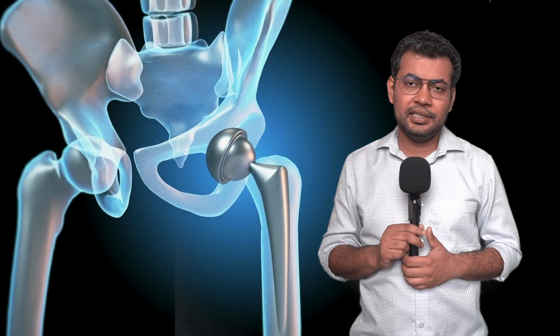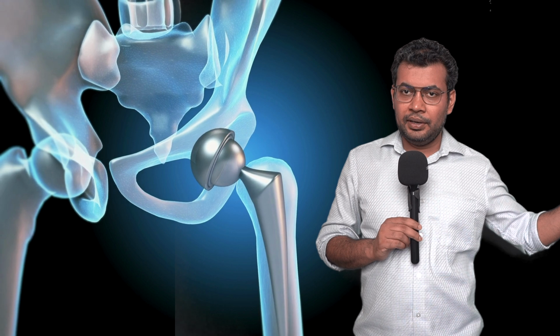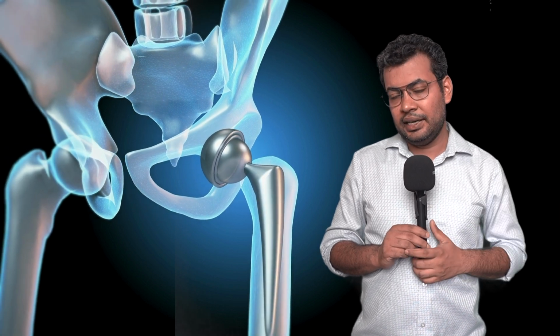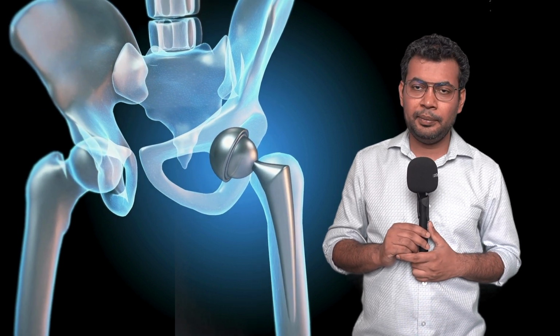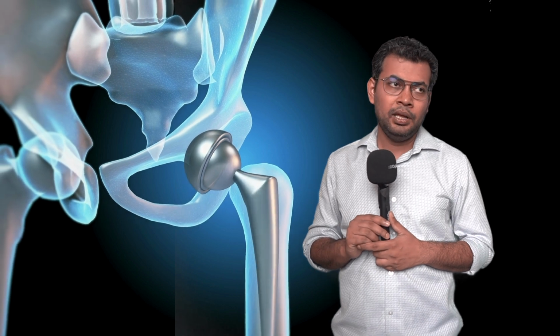And then we attach the iliopsoas muscle; there is a slot for the iliopsoas muscle in the megaprosthesis. We tie it there, and then we attach to the greater trochanter the gluteus muscles and the short external rotators. There is a slot for them, and there should be a proper reconstruction and muscular reattachment, so that we can have a better functional outcome.